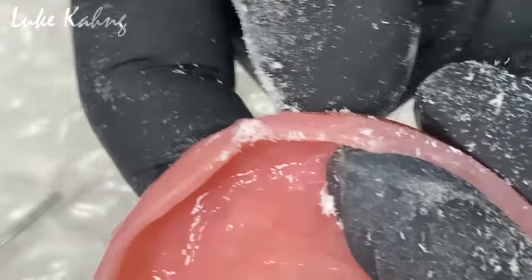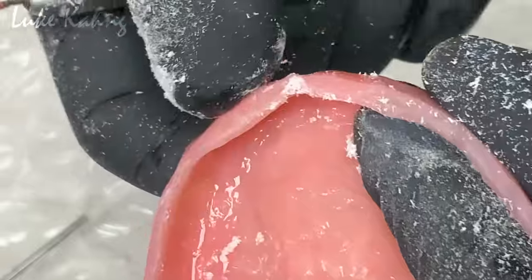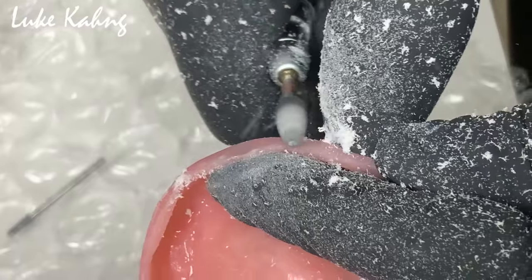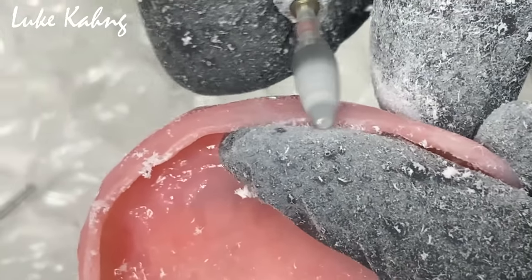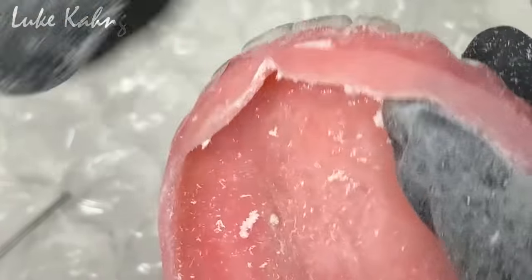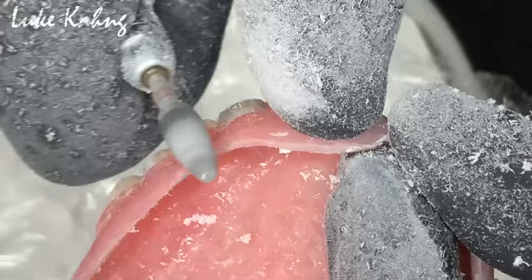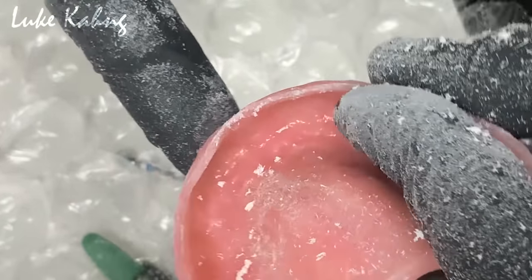You see the difference? This one's beveled. This one is still thick, right? So then you can bevel it on top so that the patient feels more natural. The lip rolling over it feels a lot more natural. And then this will be polished. Got it? Oh, that's awesome. See how it's nice and beveled now? It goes up and then nice and smoothly into the sulcus. See that? Nice.